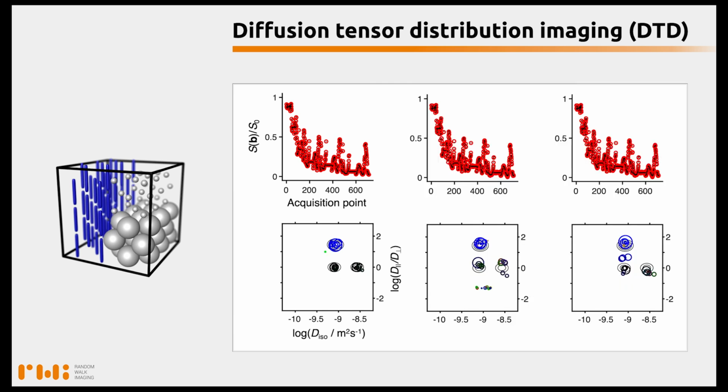Of course, you notice that the DTD algorithm features a lot of randomness, which means that the solution that we find is not unique. And this is actually a key feature of the problem at hand. Laplace transforms, which is the kind of transform we are currently solving, do not feature unique solutions.